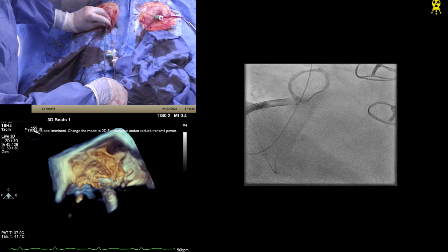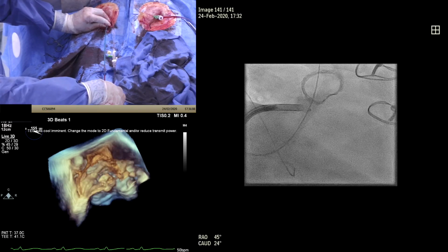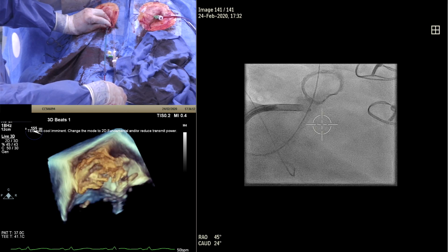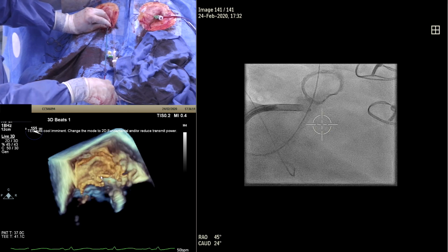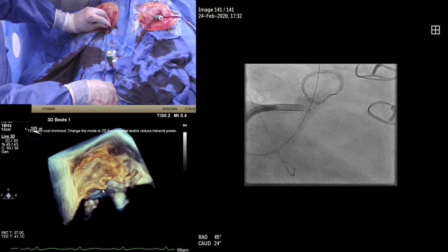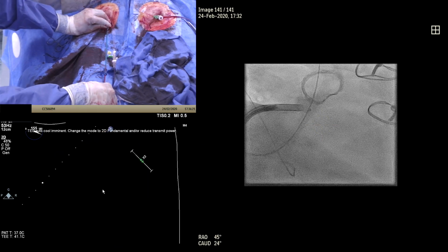Can you see above? Yeah. If I just show you here, let me turn the gain up a little bit so you can see the sheath. Actually, that looks good, doesn't it? Because it's lying like this. Yeah, it's lying longitudinally there, I think. Am I making that up, or do you think that's correct? No, you're not making it up.